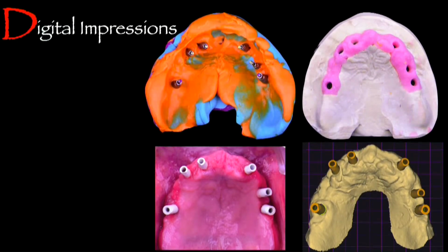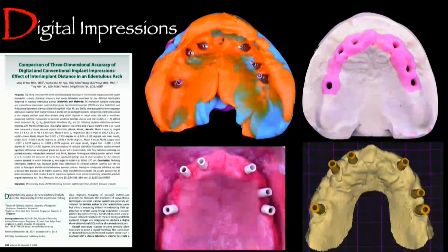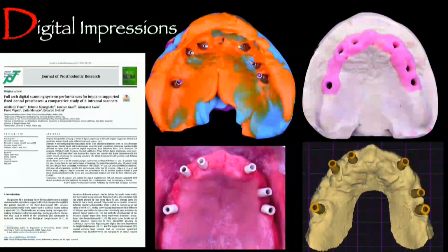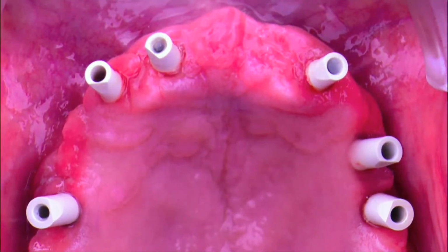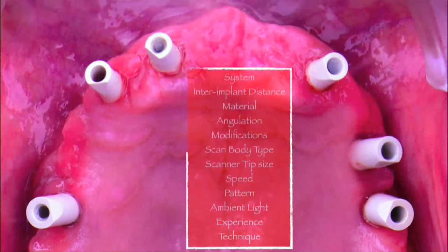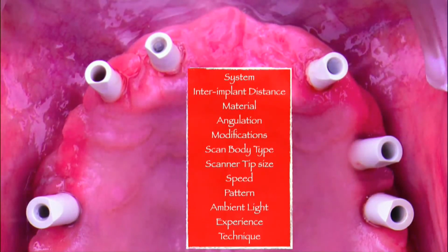So as I said before, this has been a topic of really a big attention in the literature. Many studies have been done to report accuracies of full arch scanning. And basically, they realized that we do have a problem with full arch cases, and many studies have been reported indicating the factors associated with those inaccuracies. This is to name a few, and I can easily add 2 or 3 more columns.